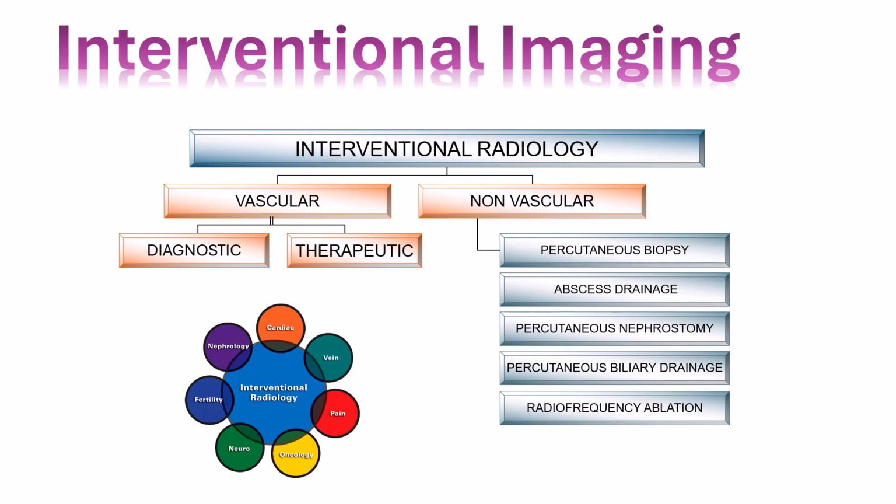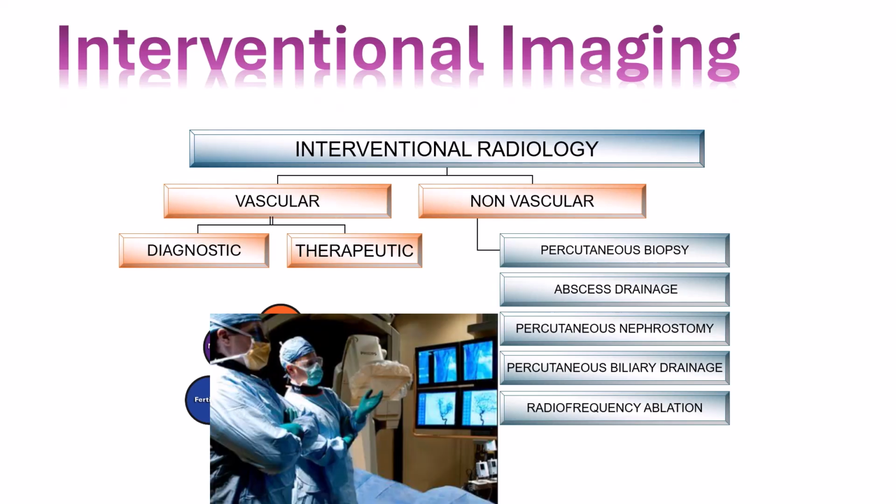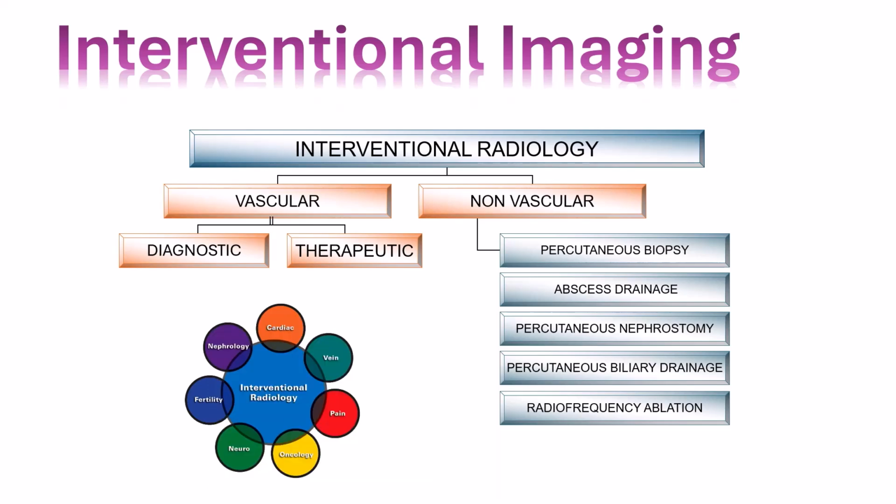Interventional radiology procedures can be vascular or non-vascular in nature. If they are vascular, they can either be diagnostic or therapeutic. If they are non-vascular, they can be things such as a percutaneous biopsy, abscess drainage, percutaneous nephrostomy, percutaneous biliary drainage, and RF, radiofrequency ablation of tissue. Obviously, there are a number more procedures that are utilized in the interventional suite, but these are just some of the major categories.